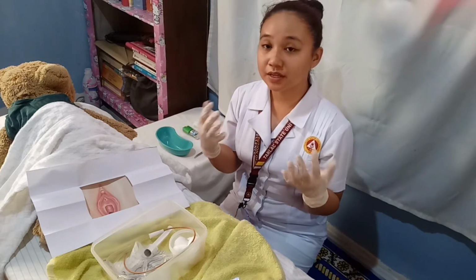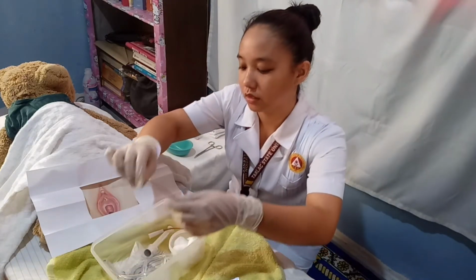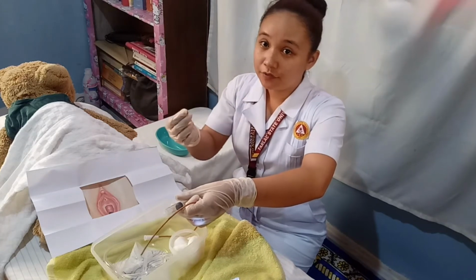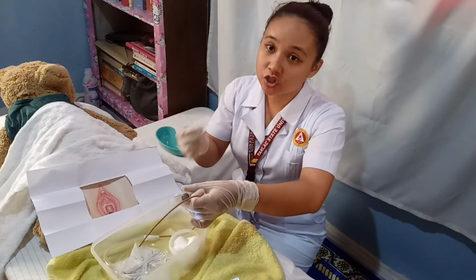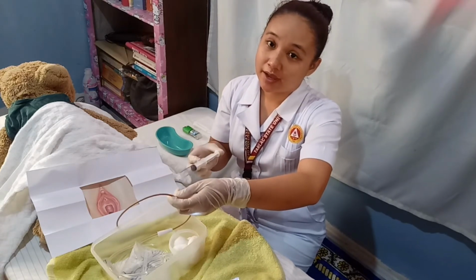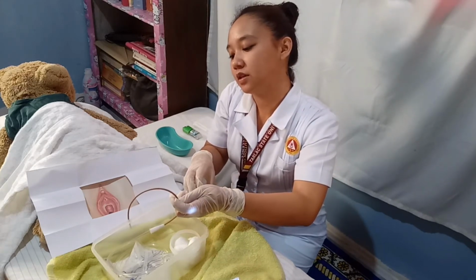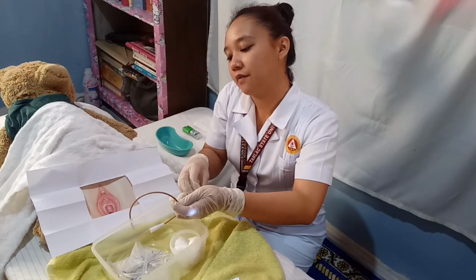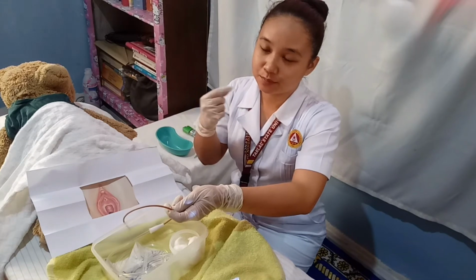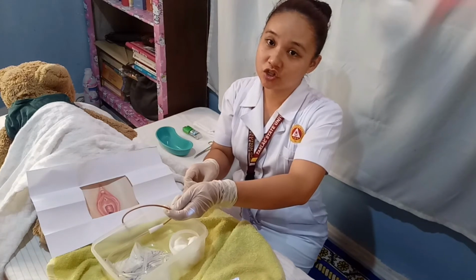If the catheter is to be indwelling, you need to test the catheter balloon. To do that, remove the cap on the tip of the syringe and attach the syringe filled with sterile water to the port to inject the appropriate amount of fluid. Let's say, for instance, we try to inflate the balloon. If the balloon is inflated properly, you need to withdraw the fluid and leave the syringe attached to the port.